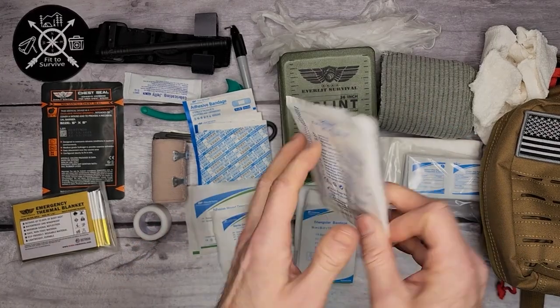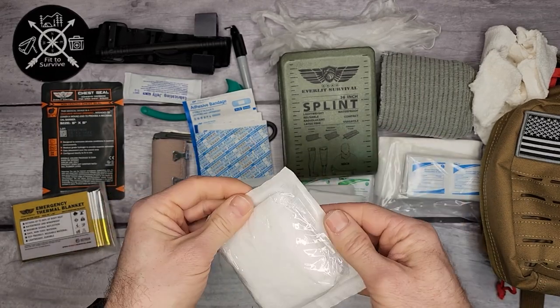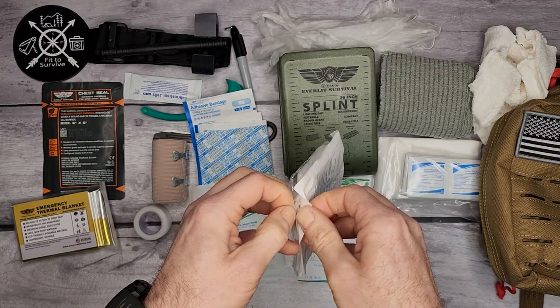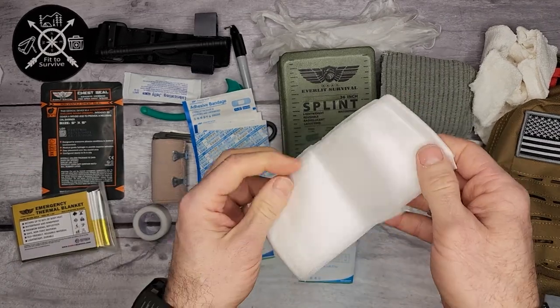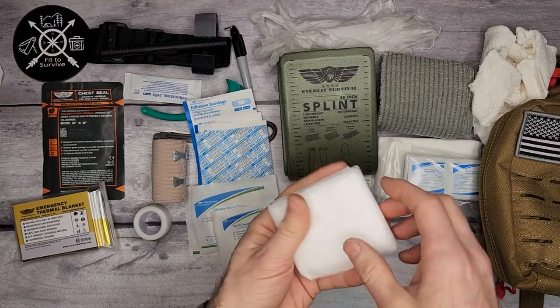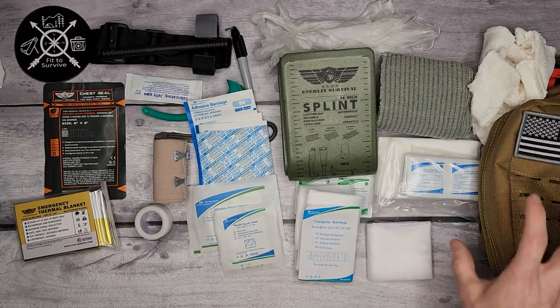And then there's a medium-size dressing. It's very similar to the triangular bandage except a little bit shorter and smaller, with a bunch of different universal uses.